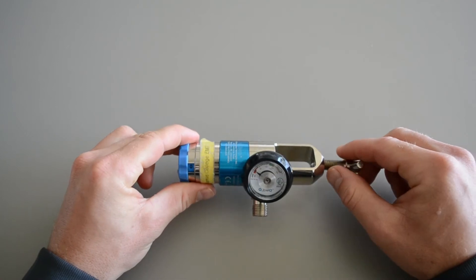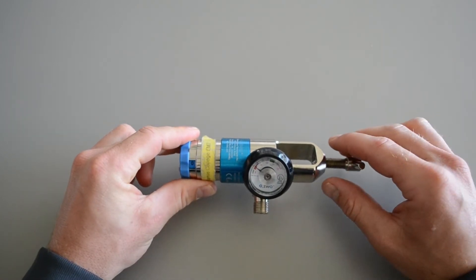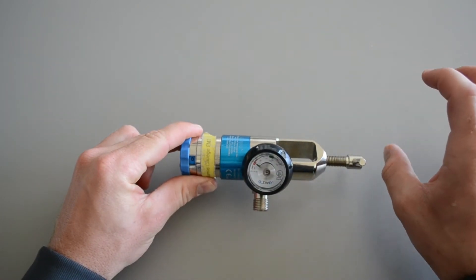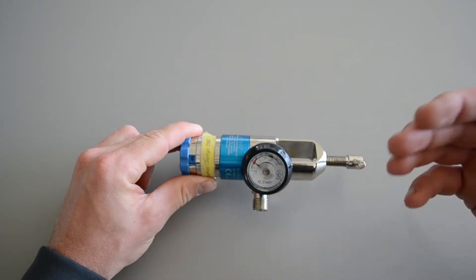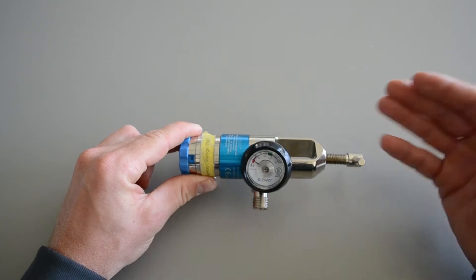So let's talk a little bit about the regulator, this is called the therapeutic regulator. It takes the pressure from inside the bottle, which is very high, and allows us to use it for a BVM, nasal cannula, non-rebreather mask.